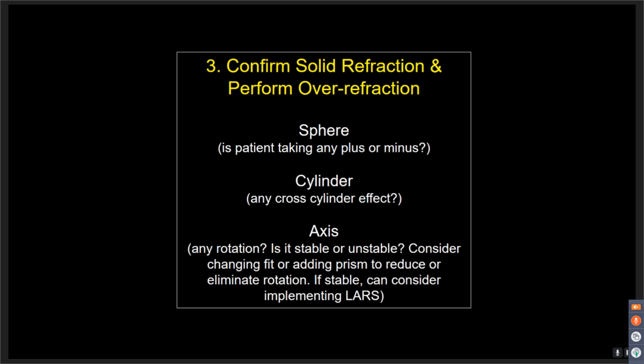When you're dealing with a multifocal toric lens, doing a spherocylinder over-refraction is a bit tricky. You have to get the patient to really ignore the reading part in order to analyze it, and it's a little bit more of a challenge to do that. I'll look at the alignment of the little marks at the 3 o'clock and the 9 o'clock, and see how aligned they are. Then you look at the amount of cylinder and just mentally decide whether, if it is torqued, that's going to make a problem for the vision.